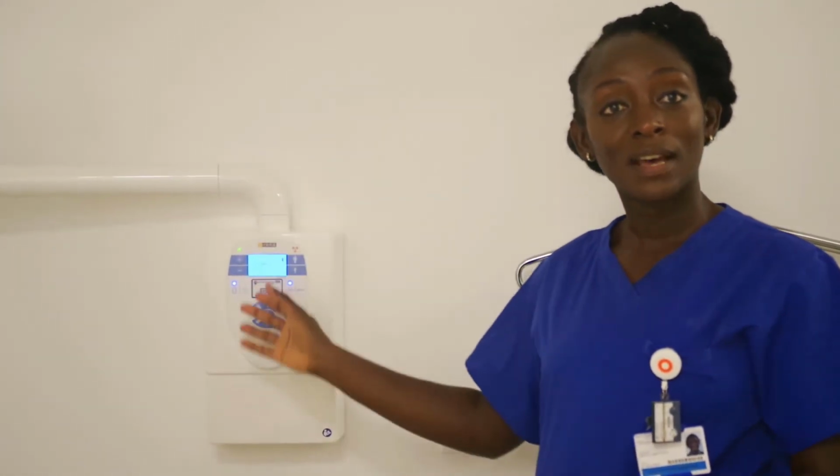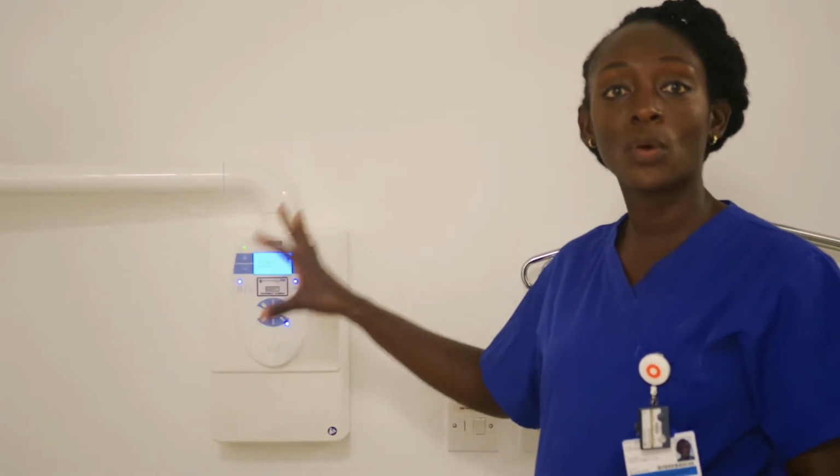Mark mentioned earlier about optimization, and we mentioned that optimization means getting the best radiograph but at the lowest dose. So we have factored this in when taking radiographs, and that's why we use 70 kV, because at 70 kV we get the high energy photons, which gives us a diagnostically acceptable image but at low dose. So now I'm going to show you the features on the control panel.